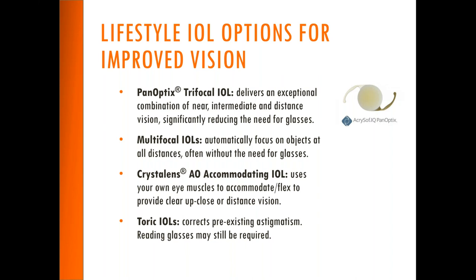This is the first implant that can address all three distances with greater success. The crystal lens accommodating implant is one we have and do implant occasionally. It is more of an implant that will allow you to have good distance and intermediate vision. The up close vision is not as sharp as the multifocals.